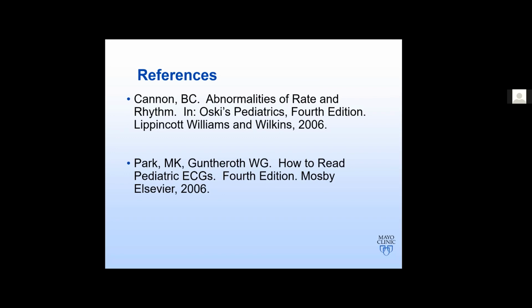But I would use more of an echo than an ECG for return to play kind of things. If they do have myocardial involvement, the official recommendation would be to probably wait 6 months before participating in competitive sports. But if there's no changes on the echocardiogram and there's just minor ECG findings, I would not consider that to be true myocarditis.